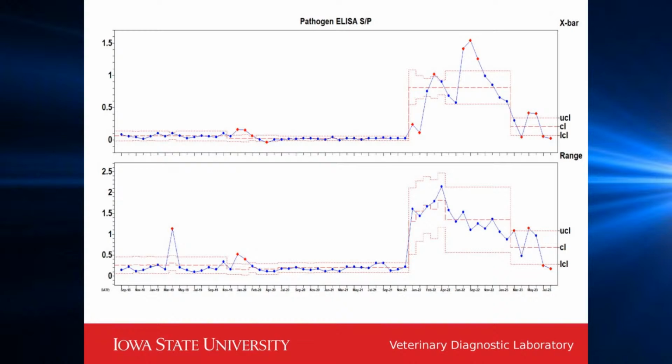What about this one, Dr. Baum? Well, I'm thinking that's just one of those miscreant samples that really lit up the test and should be retested immediately. And in most cases, it's going to come back negative.